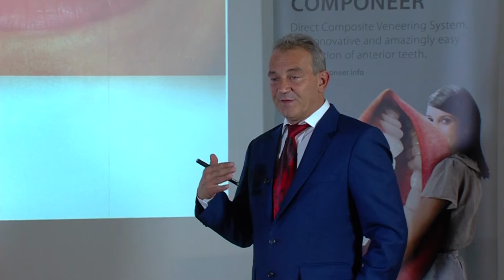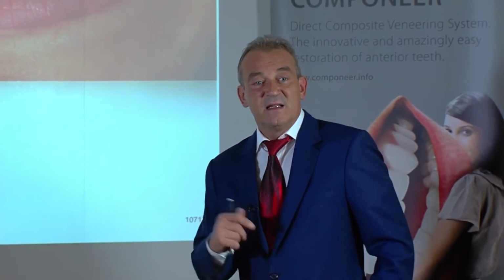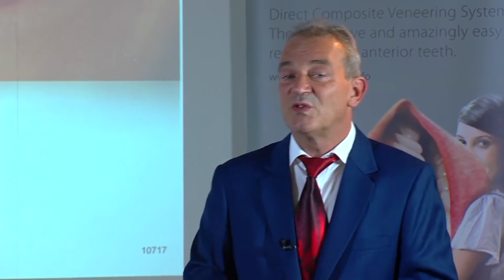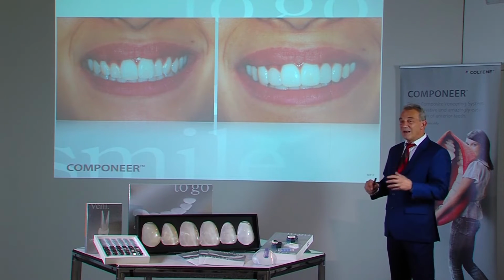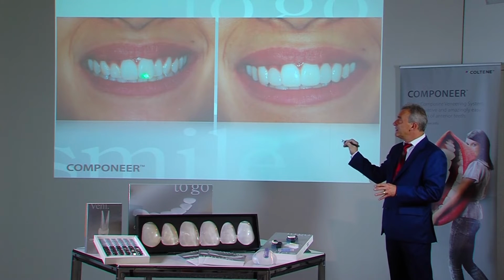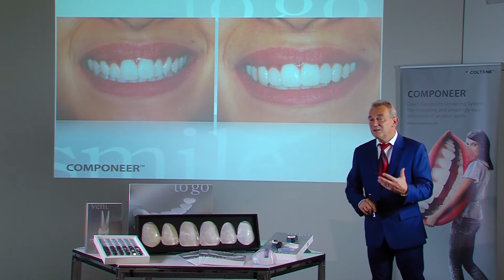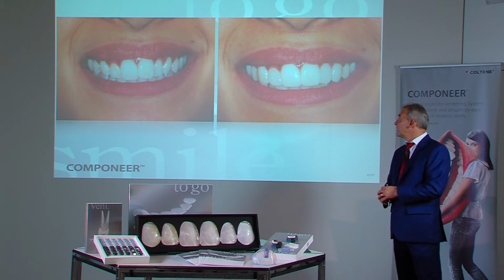Now to minimally invasive. It's important to be able to tell the patient, yes, I can do this without a great amount of preparation, even if some incorrect colours exist. Well, some small mottling or hypoplasias, such cases do not require deep preparation. Often it is quite sufficient to only roughen the enamel surface to correct this.